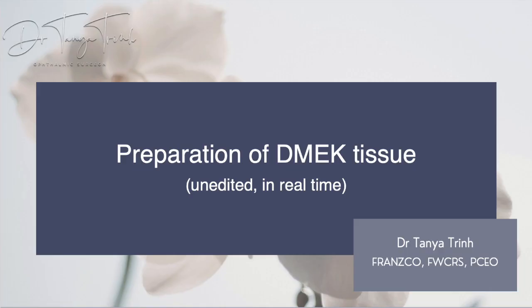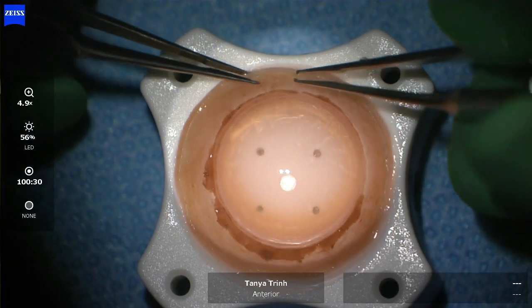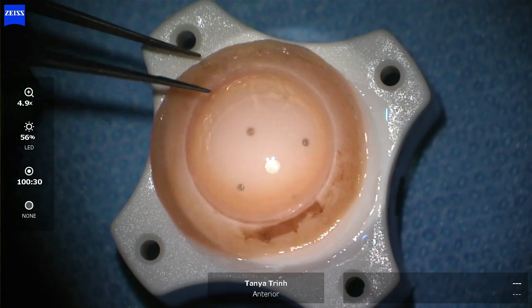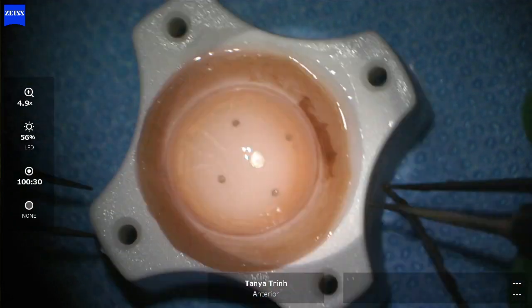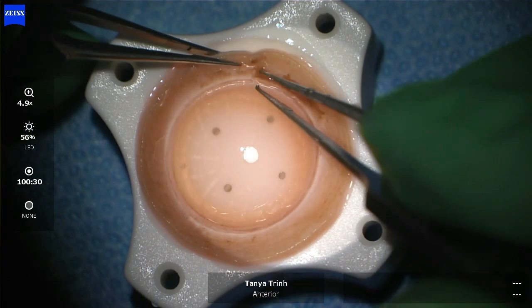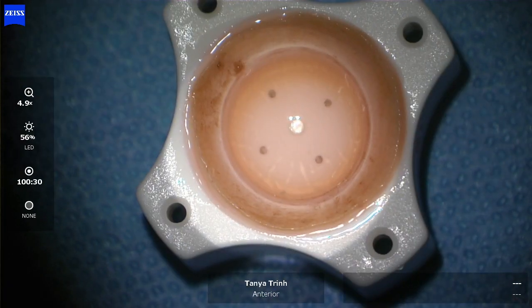This is preparation of DMEK tissue, unedited and in real time. Here I am creating the scleral sporectomy, and the aim of this is to remove the excess and sometimes densely pigmented tissue. If you've got a darker donor, that tissue can sometimes fragment and spread little pieces.